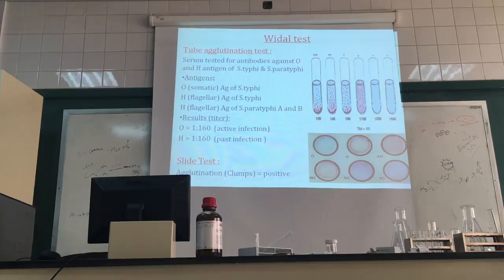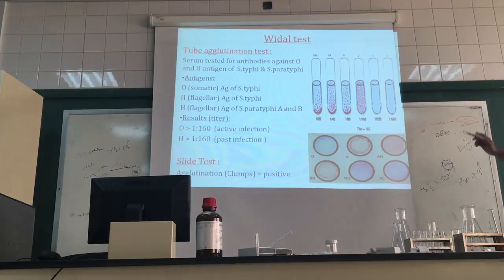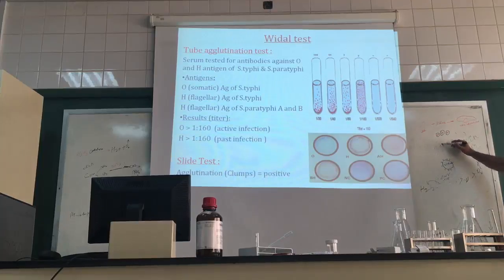When the doctor asks the patient to go for the Widal test, it's the job of the laboratory whether he will do a tube test or slide test, depending on the availability in his lab. Because this is a very quick test, and the other test needs a little more labor to perform. Usually what we look for in the antibodies is IgM and IgG.